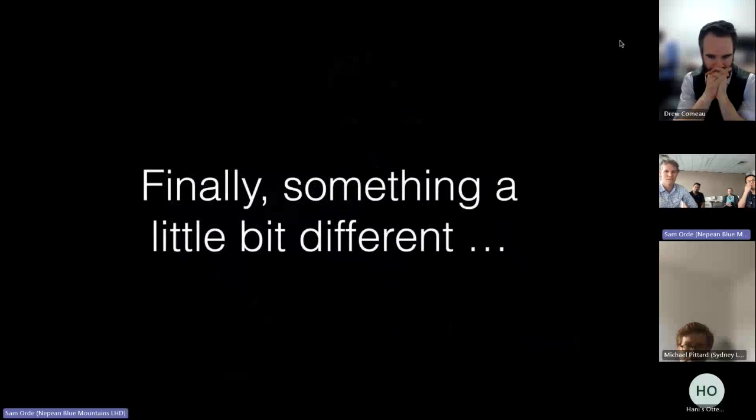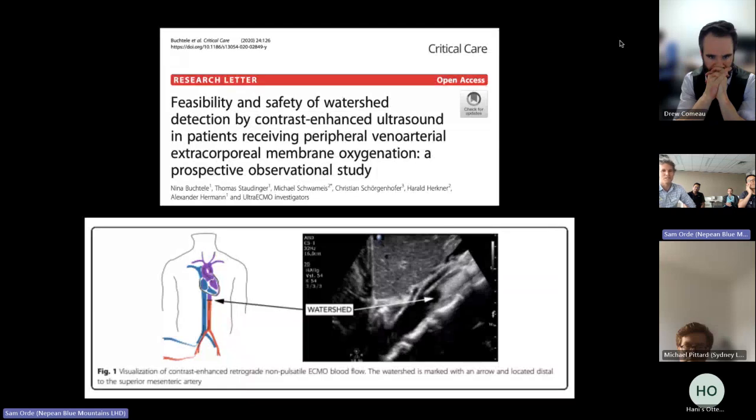Okay, last couple of things, something a little different. As well as in this research space for off-label uses, there are studies coming around, such as this one, which is a great study from, I want to say, the Netherlands. I think I got that right. It could be Germany, where they look at it for ECMO.